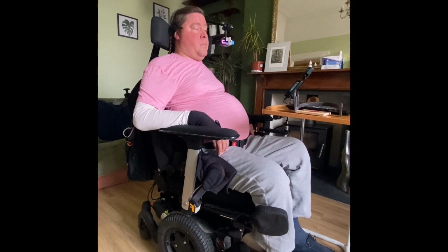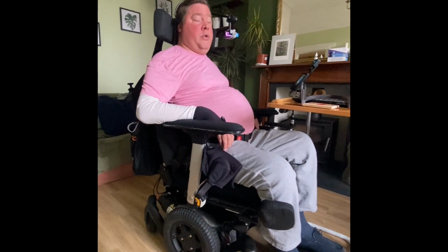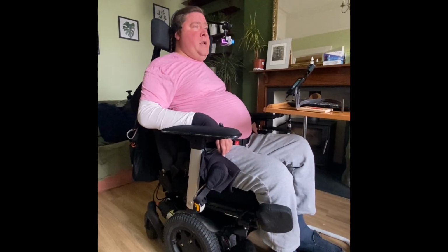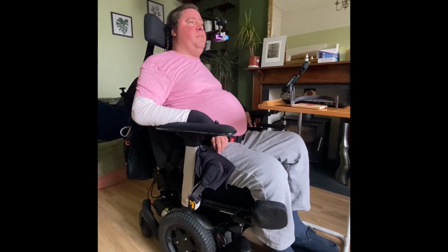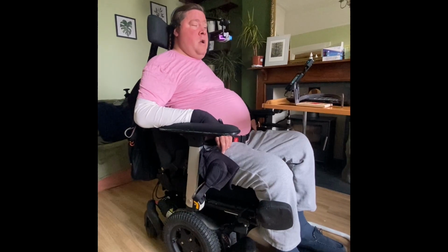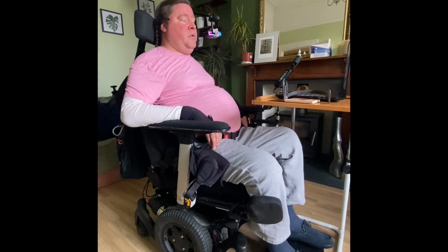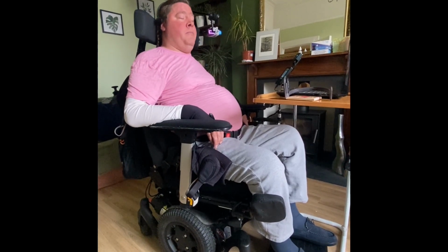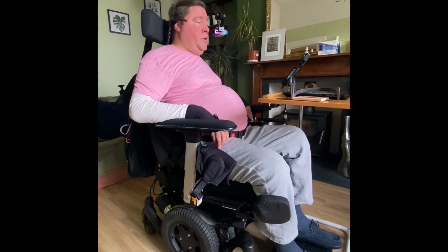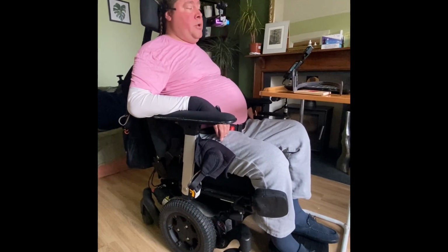And this video is to explain how the system works and how it would help a quadriplegic such as myself. To explain, I have developed three main systems, a combination of software and hardware testing. So the first system is a graphical user interface with multimodal inputs, allowing a user to log in and use a system that would control a wheelchair.